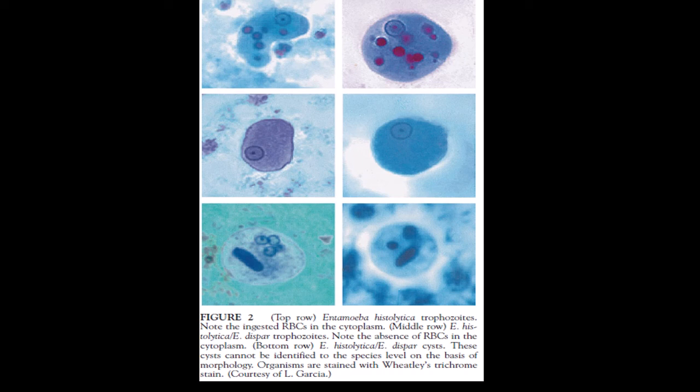Second is the nuclei here. If you have more than 4 nuclei, by definition, it's not Entamoeba histolytica, while Entamoeba histolytica has up to 4 nuclei, for example. And of course, the shapes, as I said, of the bars that contain here aggregates of ribosomes. Very, very important to know.